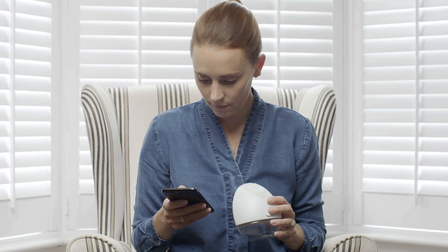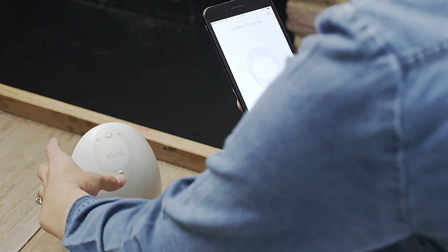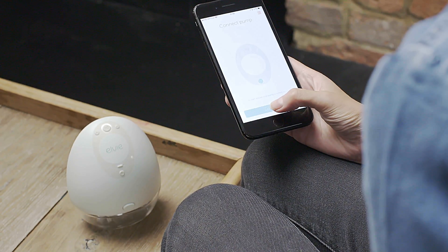The Elvie Pump can be connected to the Elvie Pump app to make expressing more convenient and discreet. Once your Elvie Pump is on and connected, you can use the app to control it.